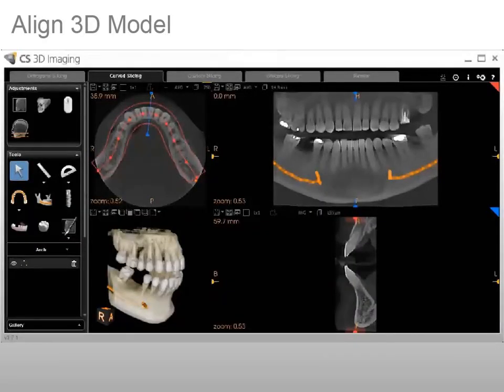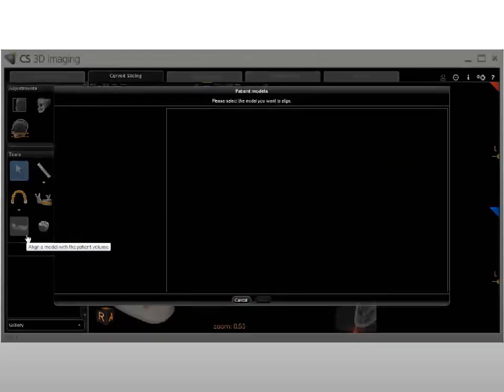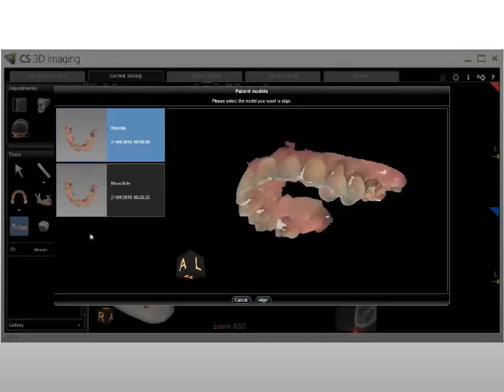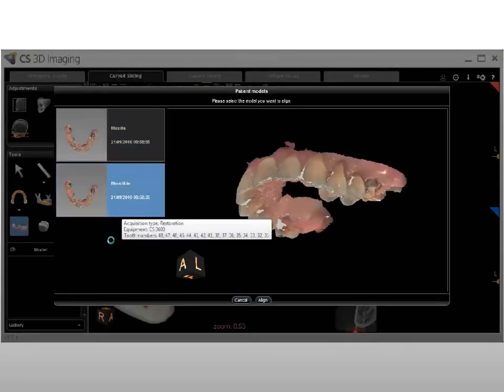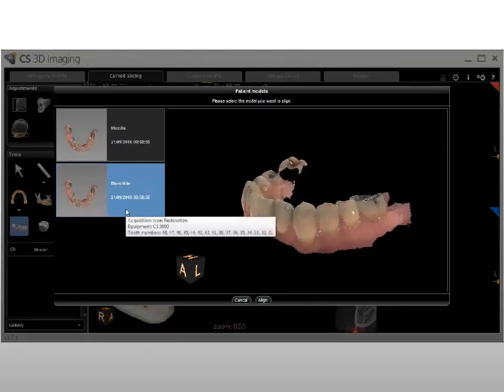To align a 3D model, after arch placement, in the Tools panel, click the Model Align tool and select a model to align with your patient volume. The Patient Models window is displayed and available models are listed, sorted by date, in the side pane. You can hover the mouse over a model to display acquisition type, equipment, and tooth numbers.